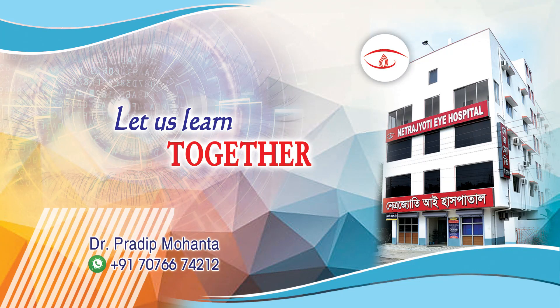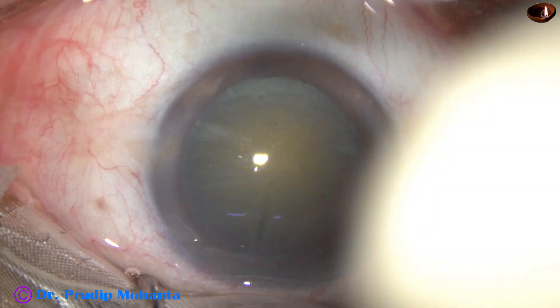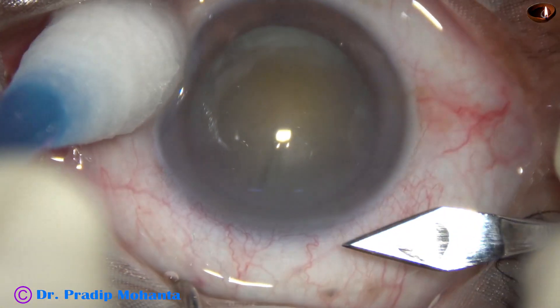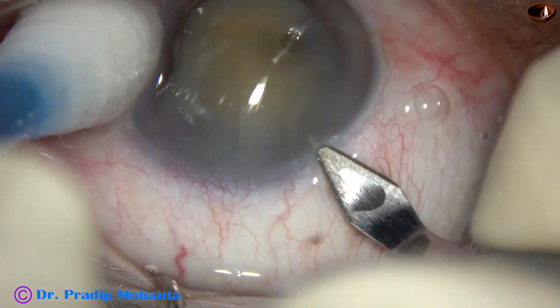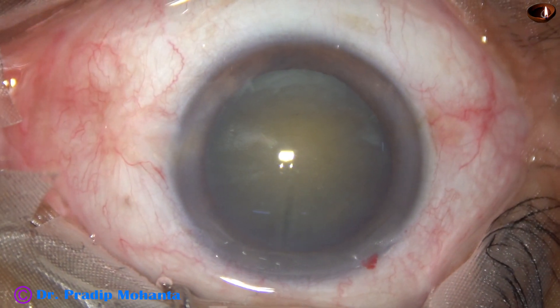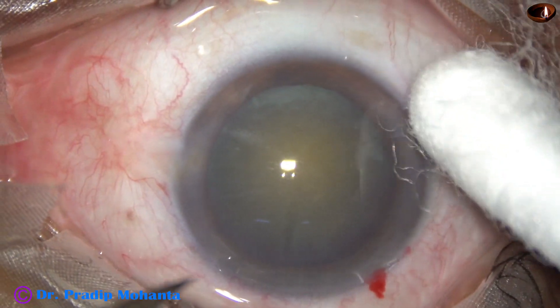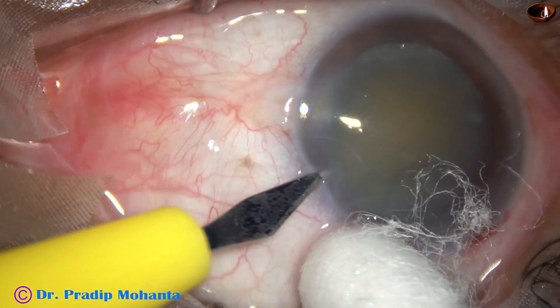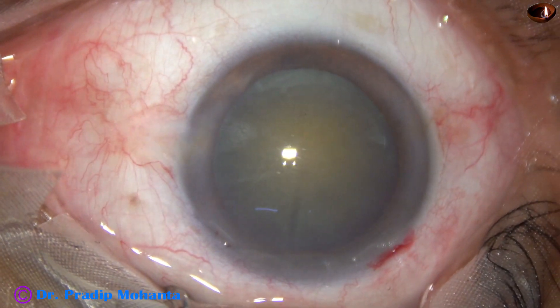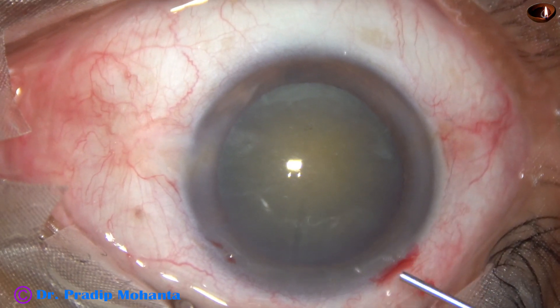Friends, welcome to my workplace at Ranaghat, West Bengal, India. This is a cataract case where there is anterior insertion of the zonule. There is only about 3mm central area in the anterior surface of the lens which is free of zonule fibers. In the rest of the areas there is some attachment of the zonules, the suspensory ligaments.